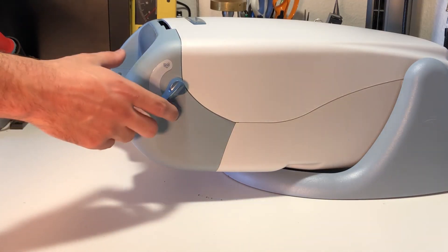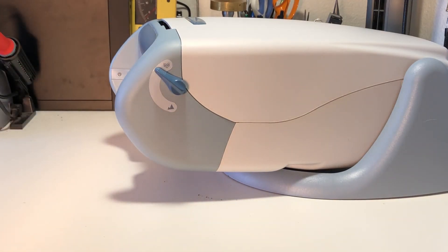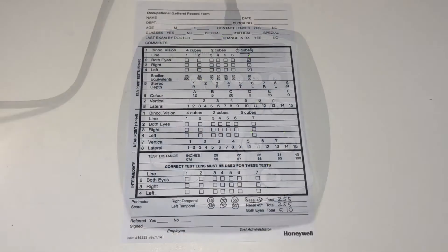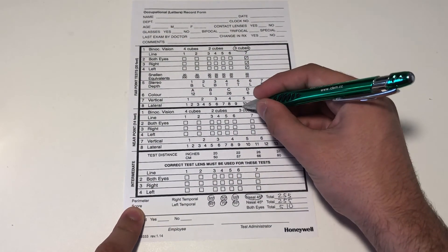Now turn the near far switch to the near position, pointing towards the book. Repeat the test at slides 1, 2, 3, and 4 using the same procedures. Record the results in the near point section of the record form.